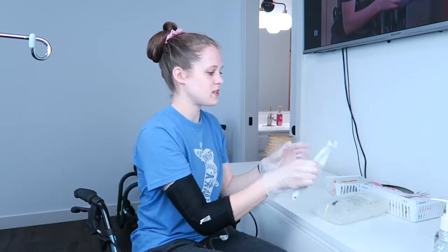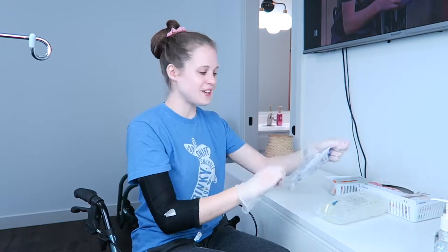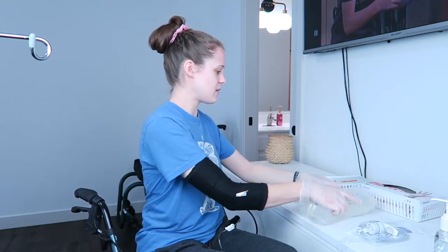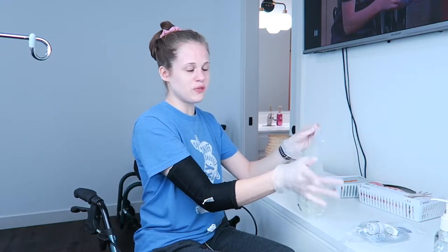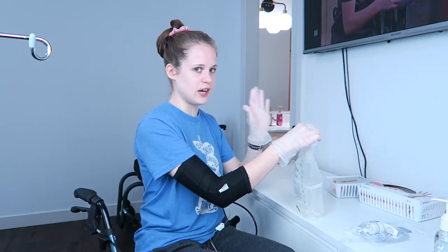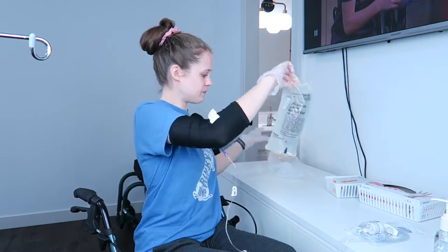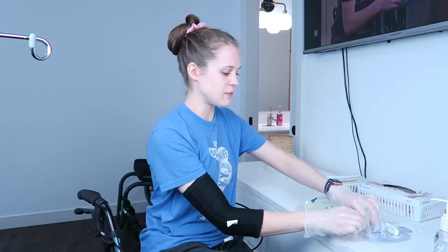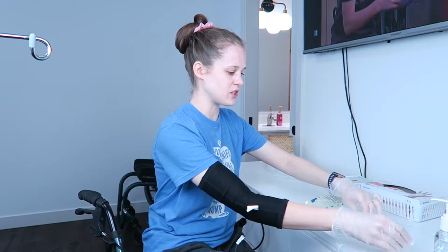Next step is I'm going to open the tubing. All right, so I'm gonna take that out, set it up on top of there. Then I'm gonna do the same thing with the bag of fluids. Hopefully you guys can hear me over the crinkling. I'll try not to talk while I'm crinkling the bag. There we go. So now, the next step is I'm actually gonna take this paper thing. It just holds the tubing together. I'm just gonna take that off.